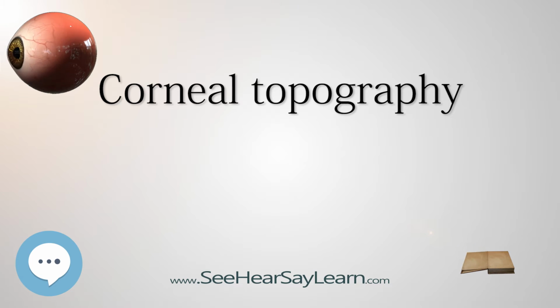In 1896, Allvar Gullstrand incorporated the disc in his ophthalmoscope, examining photographs of the cornea via a microscope, and was able to manually calculate the curvature by means of a numerical algorithm. Gullstrand recognized the potential of the technique and commented that despite its laboriousness it could give a resultant accuracy that previously could not be obtained in any other way.